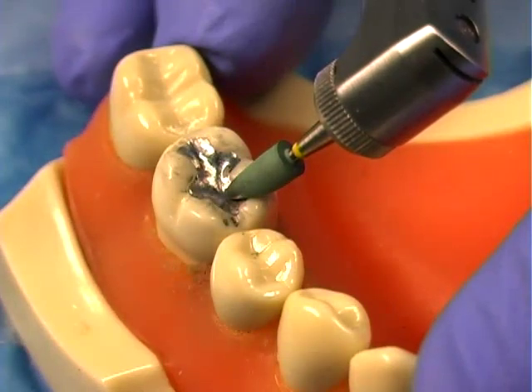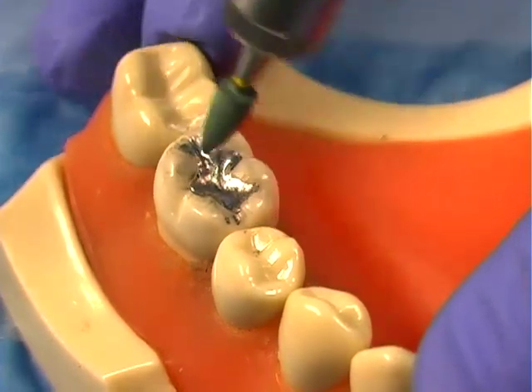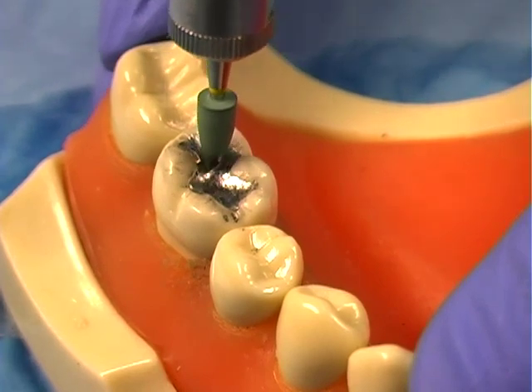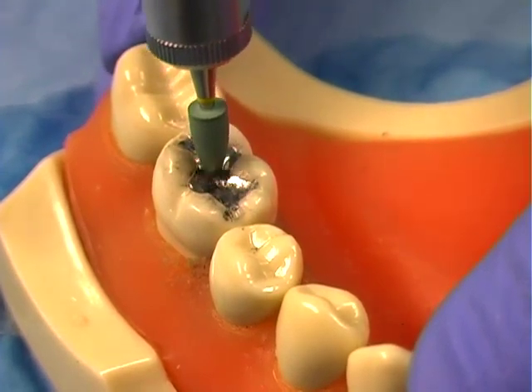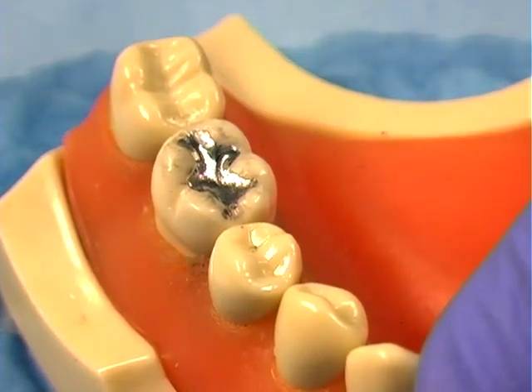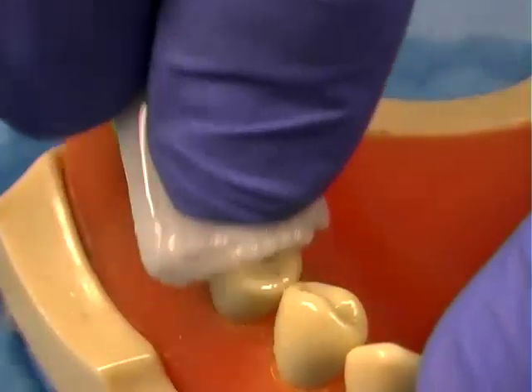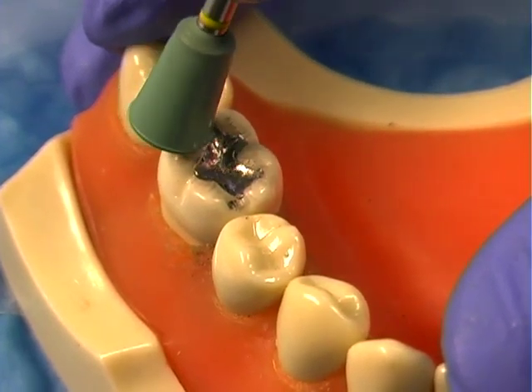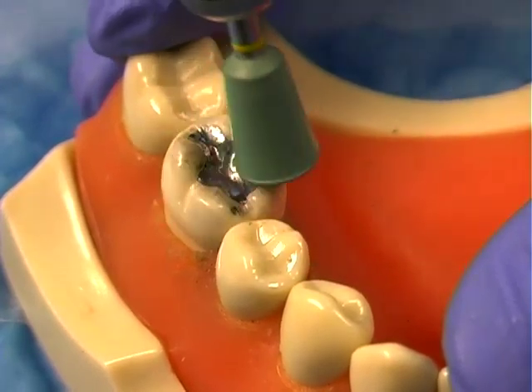The super greenies have a yellow band on the shank. Use the super greenie point to polish grooves on the occlusal surfaces. Rinse the surface with water to cool and to clean.